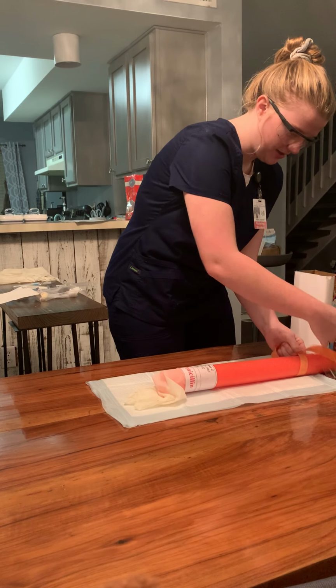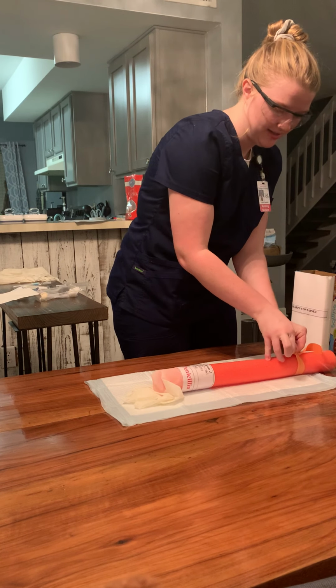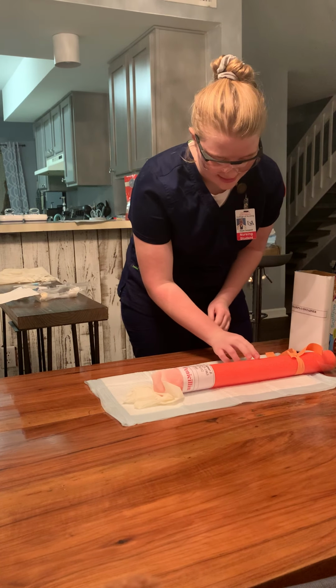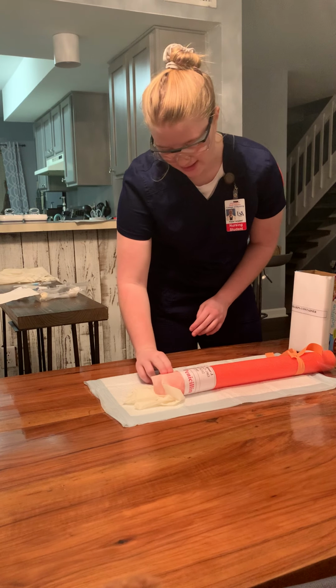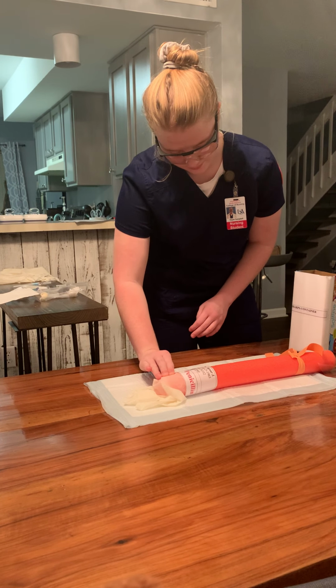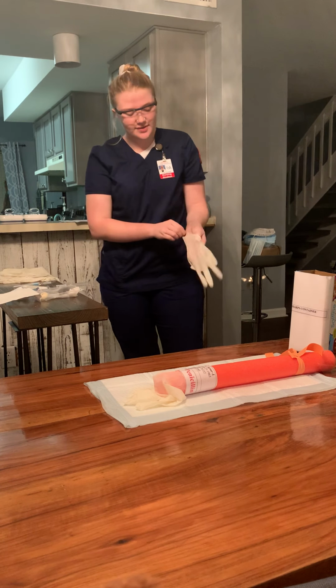And I would like to note that I do have my arm secured. If you hear any crinkling, it is from that. And so now I would assess the vein that I want to use, and then check the radial pulse. Okay, and now I would apply my clean gloves.